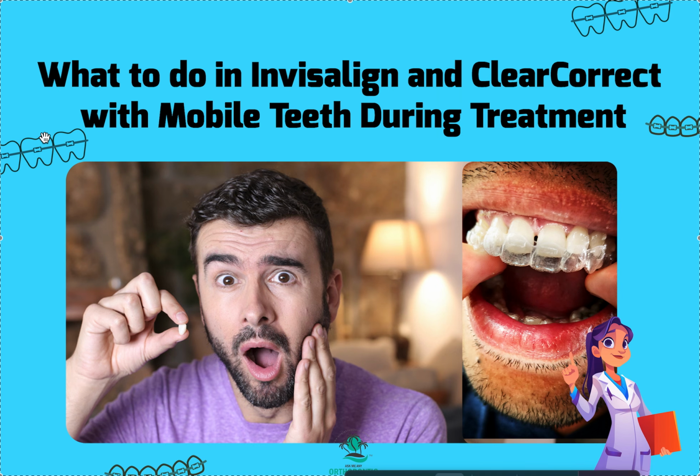You're not going to know if this case round tripped unless you know what that is and you know how to look for it. If they round trip, you're still moving the tooth forward in order to make space to do the IPR to move it back. That still messes up the tooth, okay? Round tripping is totally fine in a younger patient. I don't have a problem with it. But in an older patient, it's a problem, especially one that has perio or has a chance of mobility.